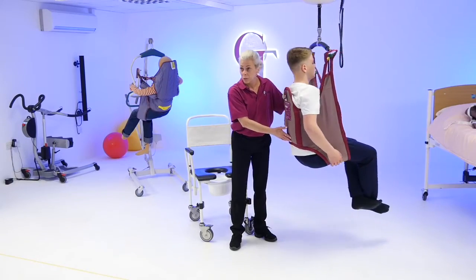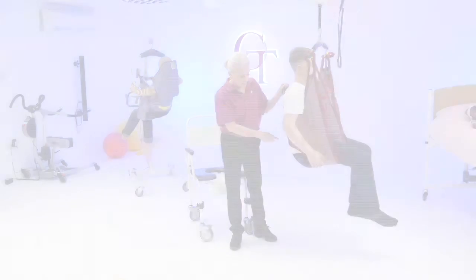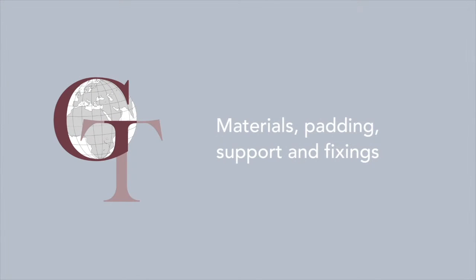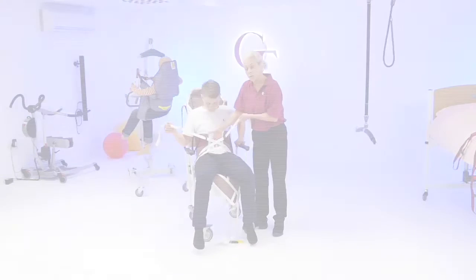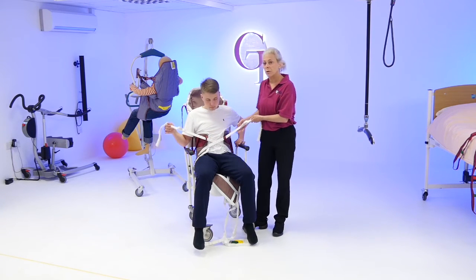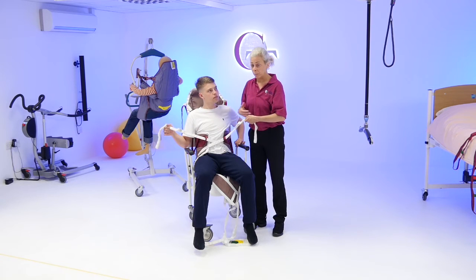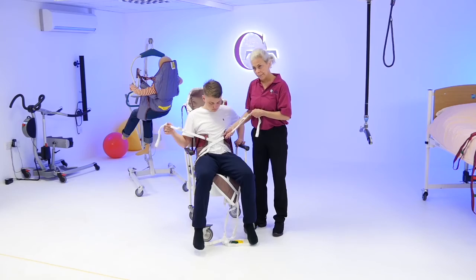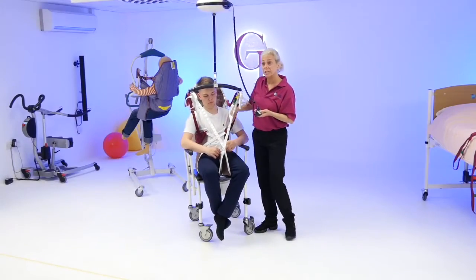I'd look at this for someone that's got slight variable tone, that's got a deeper back but still reasonable access for clothing or toileting. All these slings can also be used for general transfers. It's not going to be tight — it just has to be firm — because we're looking at a scenario with someone who has quite poor tone, so the sling has to support them firmly.